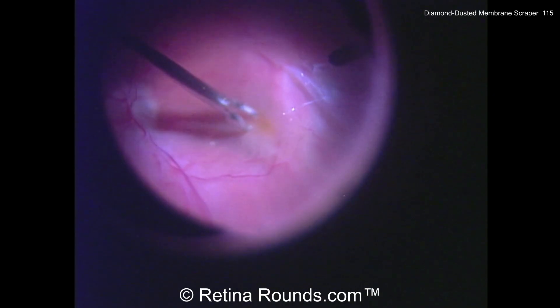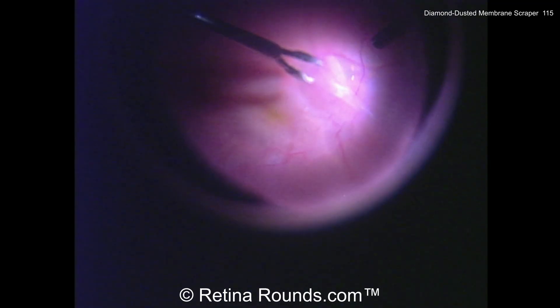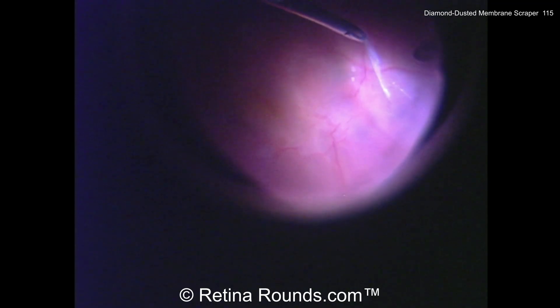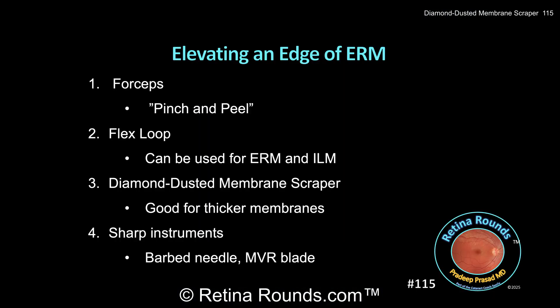You can see the epiretinal membrane retracting back here, which is a characteristic very typical of membranes and something you don't typically see with ILM. And now that last little bit of ERM can be removed.